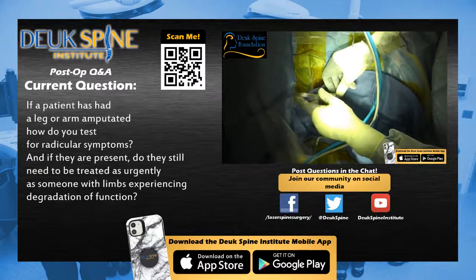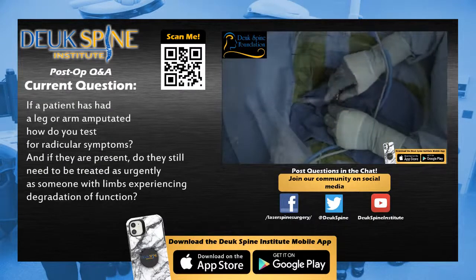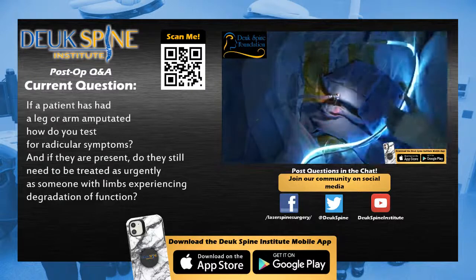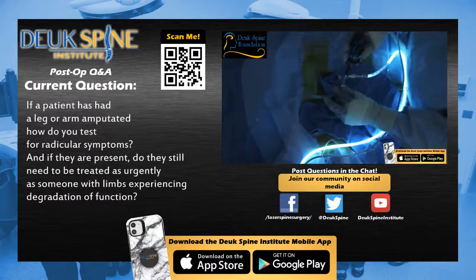Our patient should be able to go home in about 30 minutes. They're waking her up right now. She was intubated, asleep, with a tube down her throat on a ventilator, totally out of it for the surgery. That's how we do the cervical ones. For the lumbar cases, the patients are usually awake for part of the surgery, same as the thoracic.